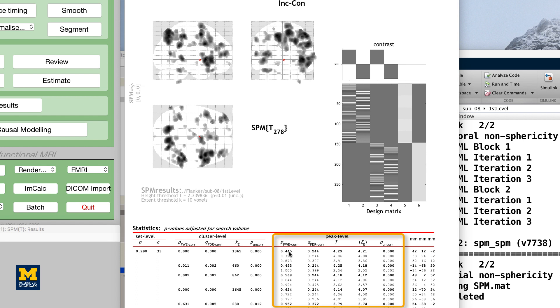The Peak Level column shows the T and Z statistics of the peak voxel within each cluster, with the main clusters marked in bold and any sub-clusters listed below the main cluster, marked in lighter font. Lastly, the MNI coordinates of the peak for each cluster and sub-cluster is listed in the rightmost column.